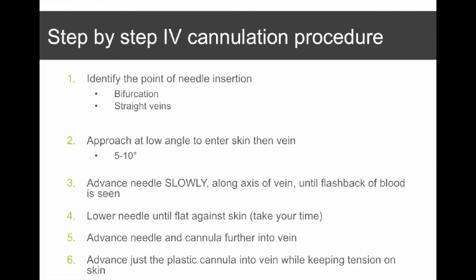I then advance both needle and cannula further into the vein, and the distance you advance that cannula is something that will be variable based on the size of your cannula, which means that the size of the bevel will be different as well. And we'll go through that in a second. After I'm at the appropriate distance, I then advance just the plastic cannula into the vein using my pointer finger, which was at that point free. All the time, I'm keeping all my structures the same, I'm keeping the tension on the skin, and I'm not moving anything differently.